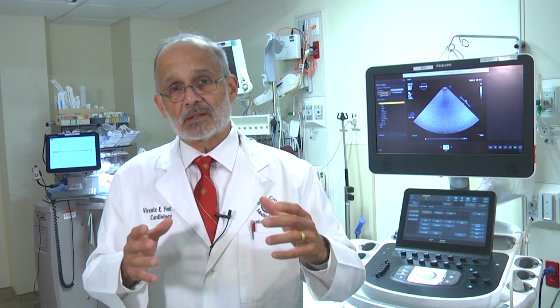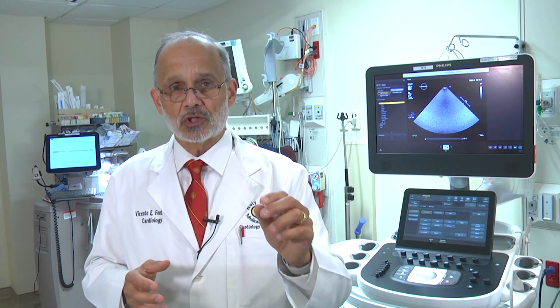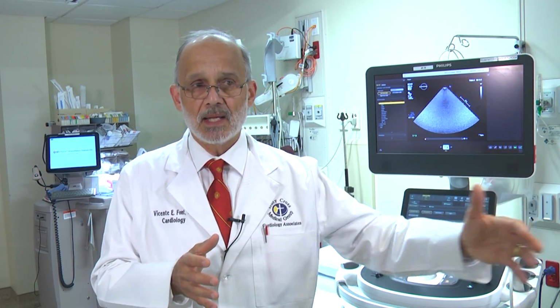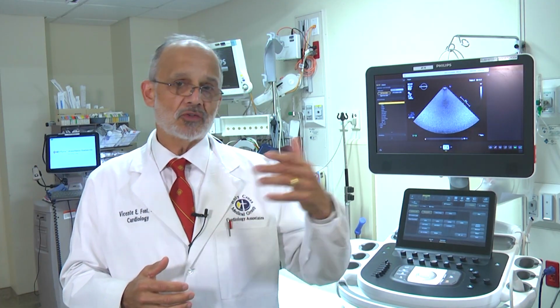Clearly, it's a very simple test to do. It takes 15 to 30 minutes to perform a complete exam. Very valuable screening device for early diagnosis, but also very useful for following a certain cardiac condition over an extended period of time. Last but not least, it's a relatively inexpensive test compared to the other high-end technology that we have, MRIs and CAT scans.